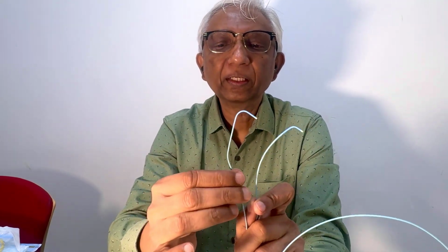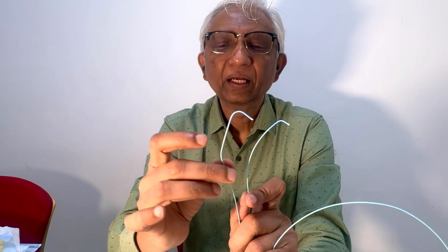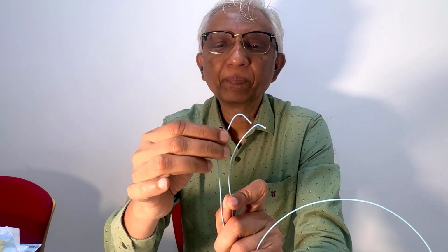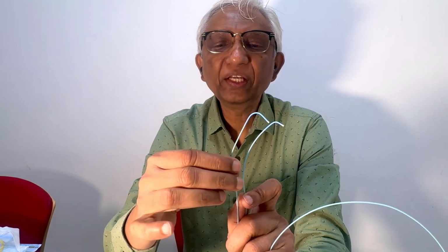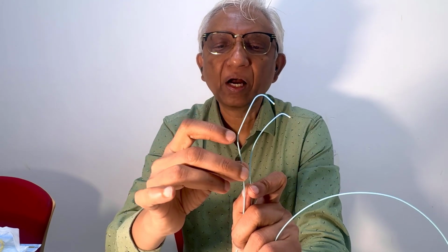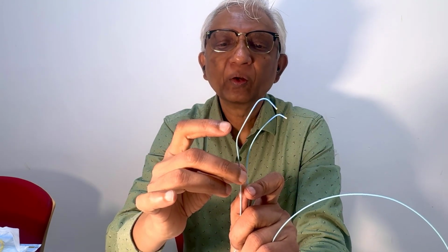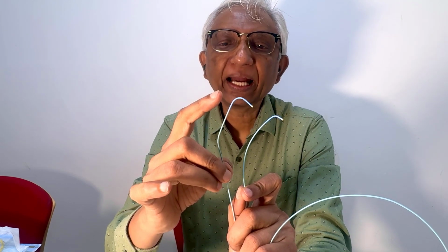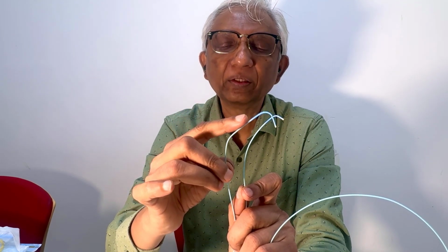Now, can you see this one? It has got a very prominent secondary curve, a longer tip, and a tighter curve. So it's very useful to get into renal arteries. What exactly happens is this outer convexity will actually touch the wall of the aorta, and it kind of pushes this tip to go into the renal artery.